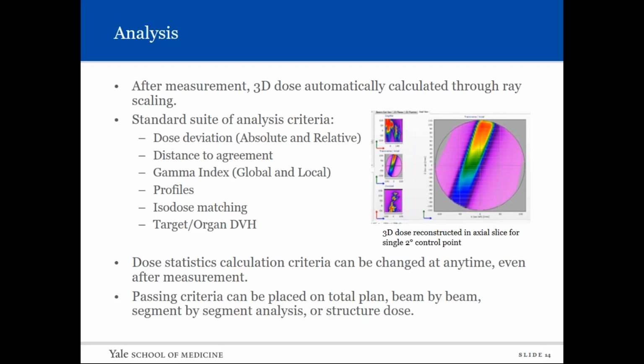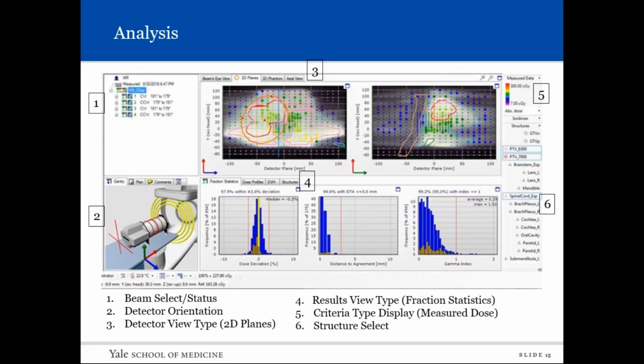And it's just, without a good understanding of it, it's hard to relate the parameters to other people in your clinic. So you should spend a little bit of time looking into that. And it can always be changed later on. You can compare the results doing it different ways. So yeah, analysis is quite quick and very easy to work with.